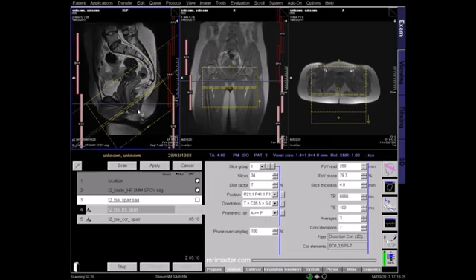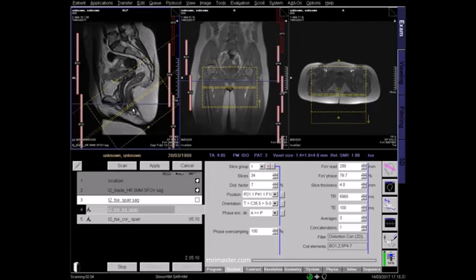Slices should run perpendicular to the anal canal. Once again, it's very important to cover from the mid-rectum right down to the skin surface of the buttock, as fistulae can track through the tissues to open through the skin.